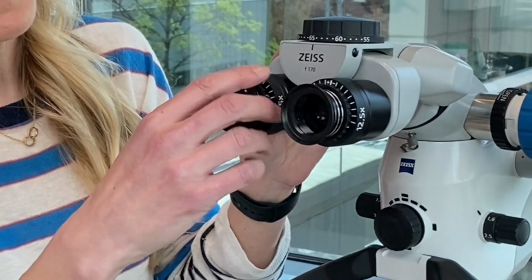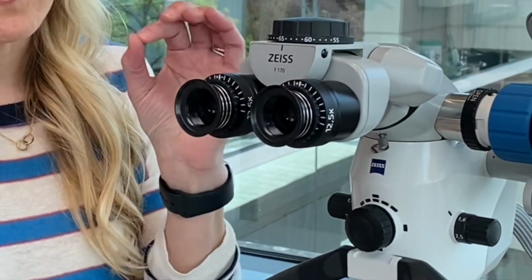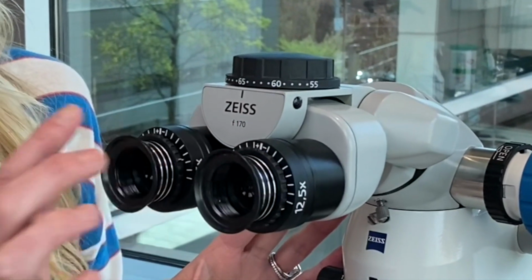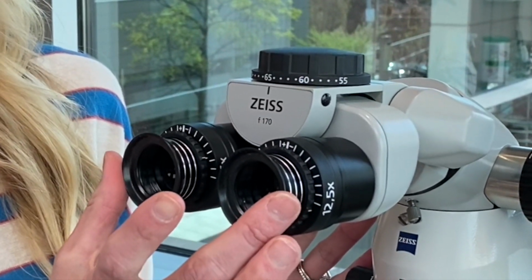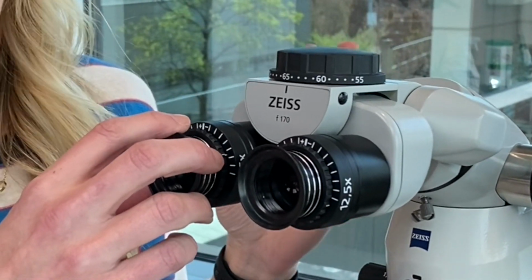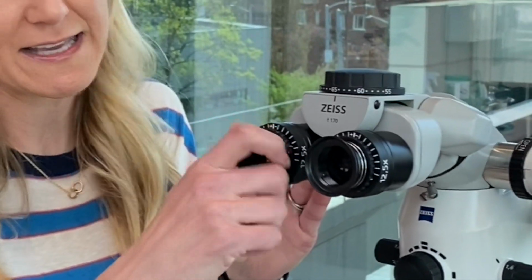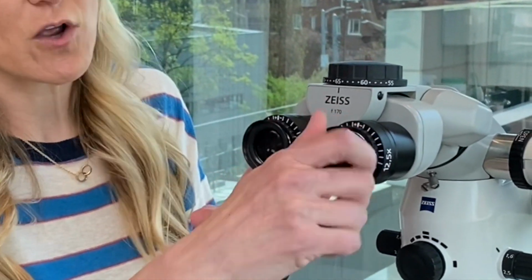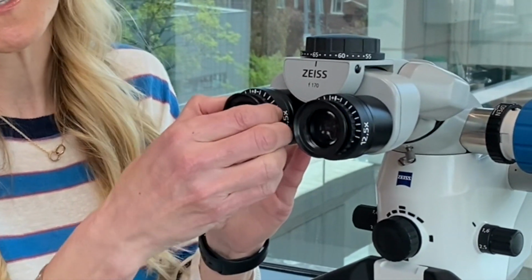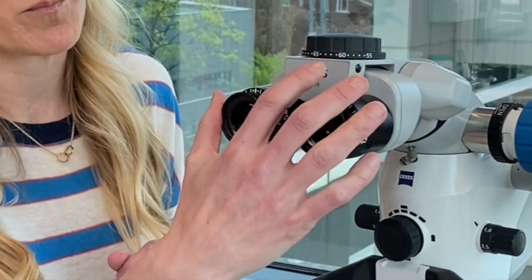Another thing that these have is these little eye cups. Because I'm not using eyeglasses when I'm looking through the scope, I would have these dialed all the way out, and what this does is it improves your field of view. So for somebody who is going to wear their corrective lenses while they're using the microscope, which you certainly can, you're going to dial these all the way back in so you have some room for your lenses, and then you would dial these to 0 because your corrective vision is coming from your glasses, not from the scope itself.